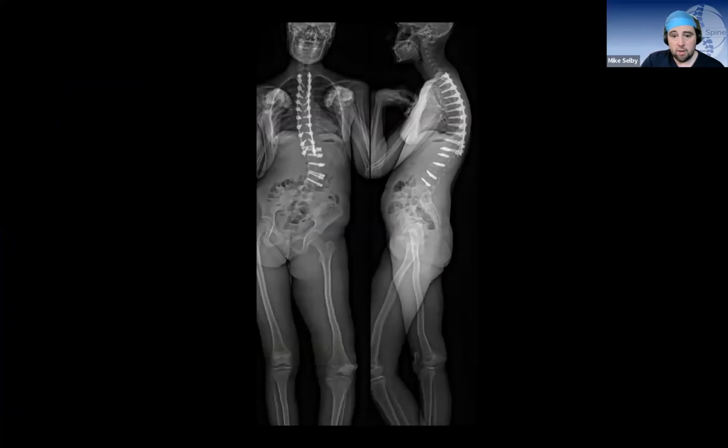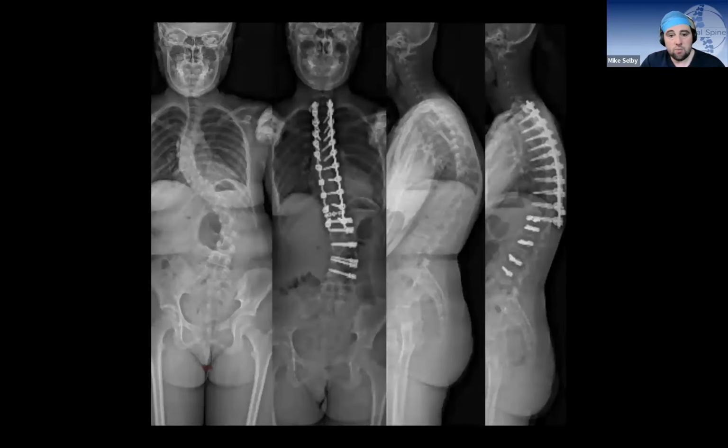So I split the anterior part so I can get my screws for anterior tethering, my second row of screws, more posterior. So we're not being too kyphogenic. Of course, I was super worried when I saw this, but then I saw, okay, she's dropping her pelvis. She's flexing her left hip. This is kind of a muscle thing post-op, and I was really hopeful it will come good with time. So we've put her through a lot of physio, a lot of scoliosis-specific exercise work.